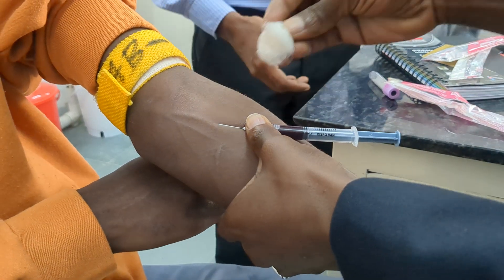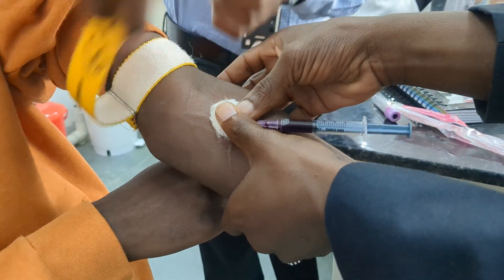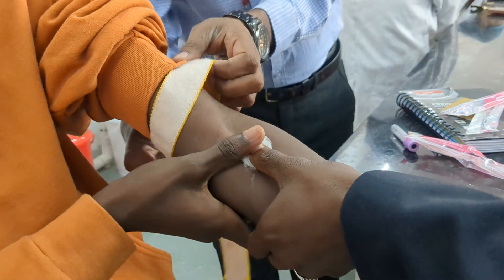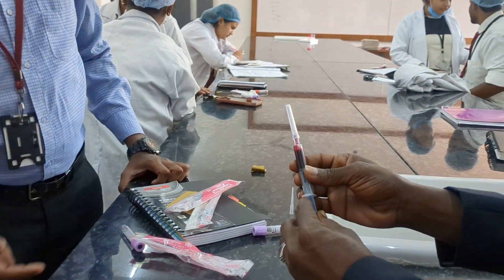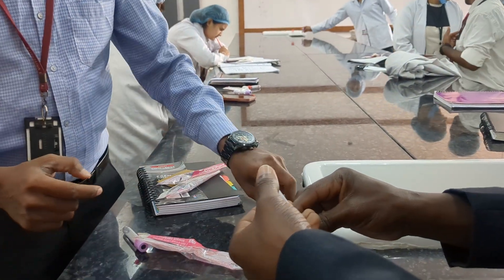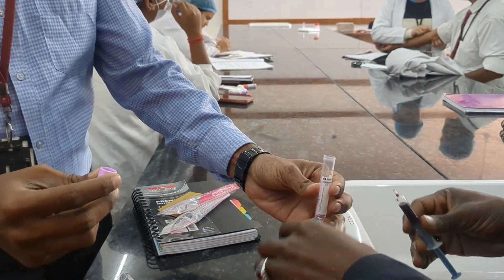Upon getting a sufficient amount of blood, remove the tourniquet, apply cotton there, then gently close the needle and collect the blood into the EDTA tube.